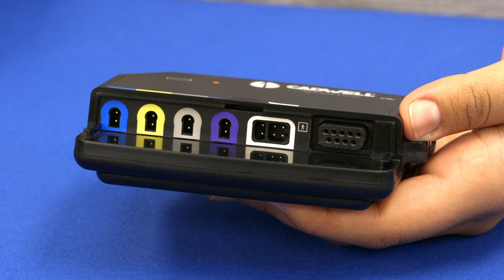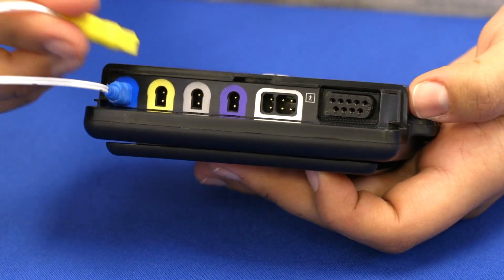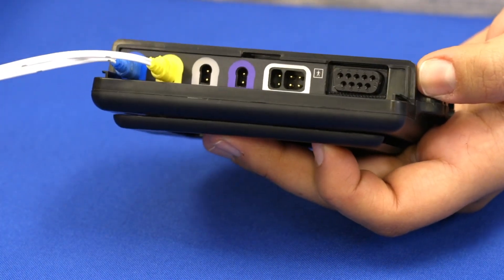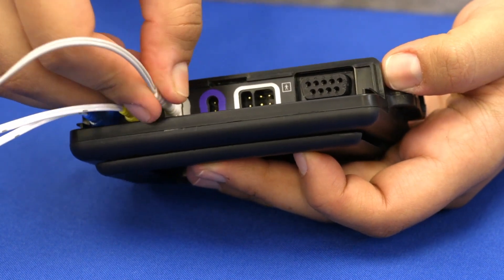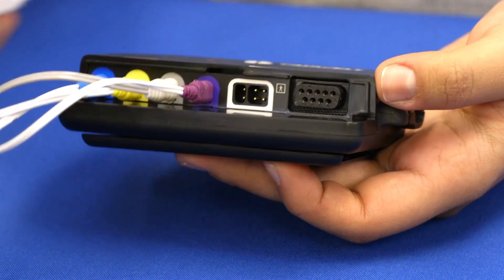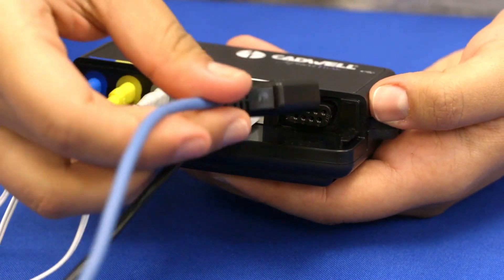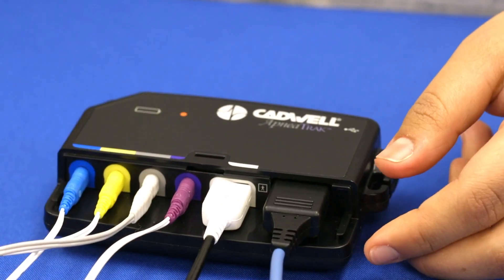The sensors are color coded to match the connection ports on the apnea track. Connect the blue input from the chest belt cable into the blue port. Connect the yellow input from the abdomen belt cable into the yellow port. Connect the gray input on the thermal sensor cable into the gray port. Connect the purple input from the snore sensor cable into the purple port. Connect the white input from the EXG cable into the white port. Plug the black connector from the finger oximeter sensor into the black port. Replace the port cover.